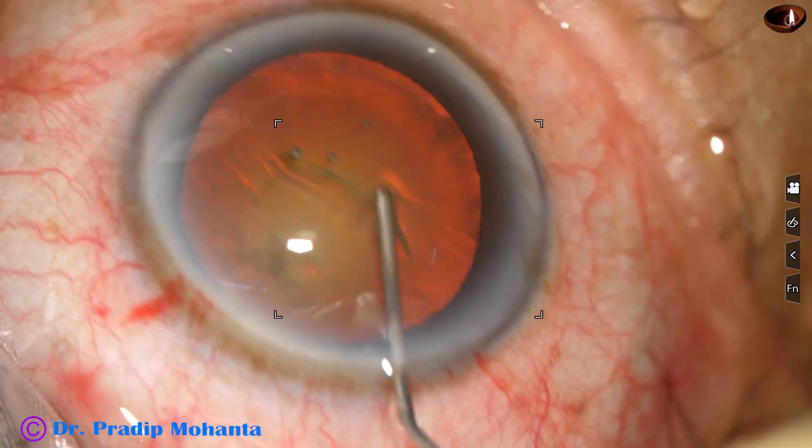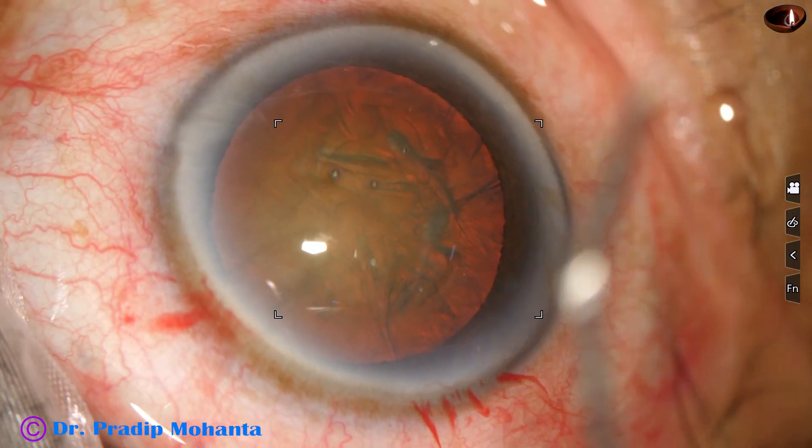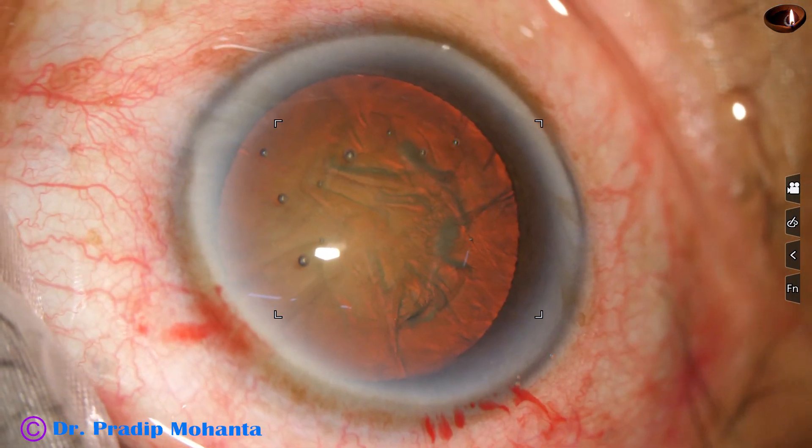Hydrodissection is done with BSS and a 27 gauge cannula and the nucleus is mobilized. The anterior chamber is filled up with viscoelastic 2% HPMC.